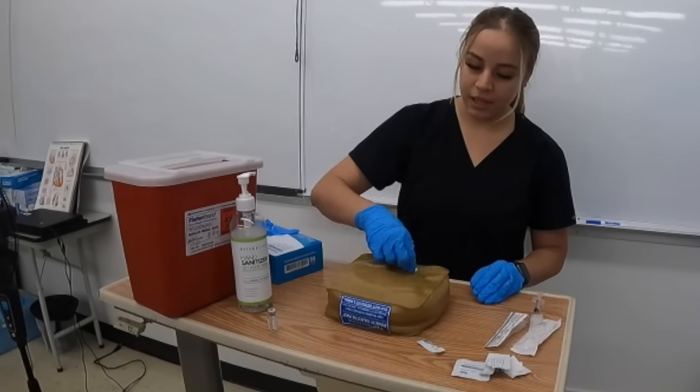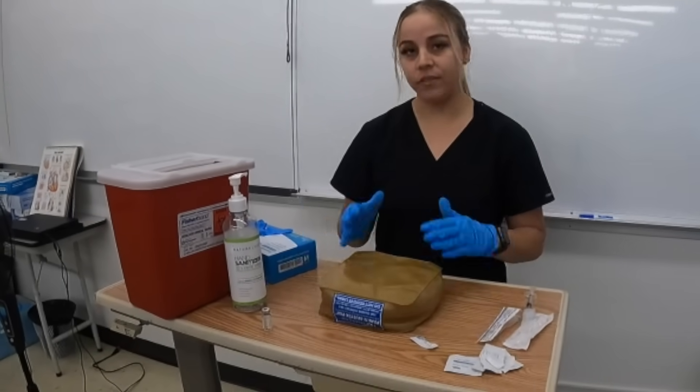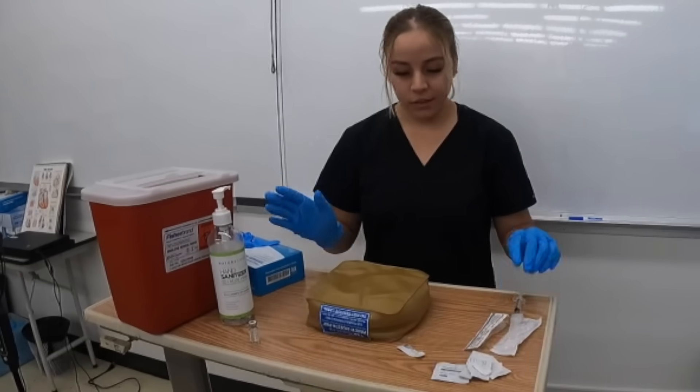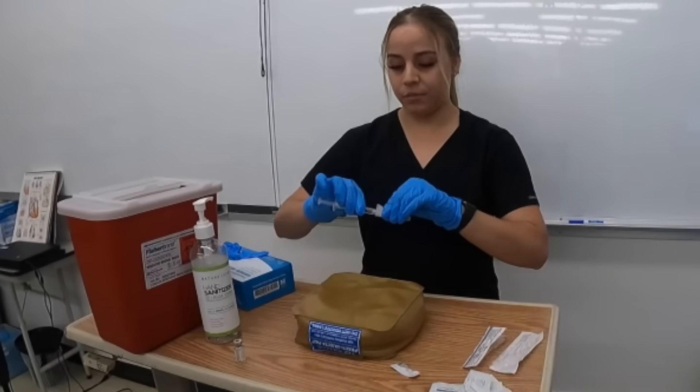I'm demonstrating the Z-Track method for inserting an IM medication. I've done all the checks — right medication, right dose, right route, right time, right patient — so now that I've prepped the patient, I'm going to take the cap off using the horizontal method.